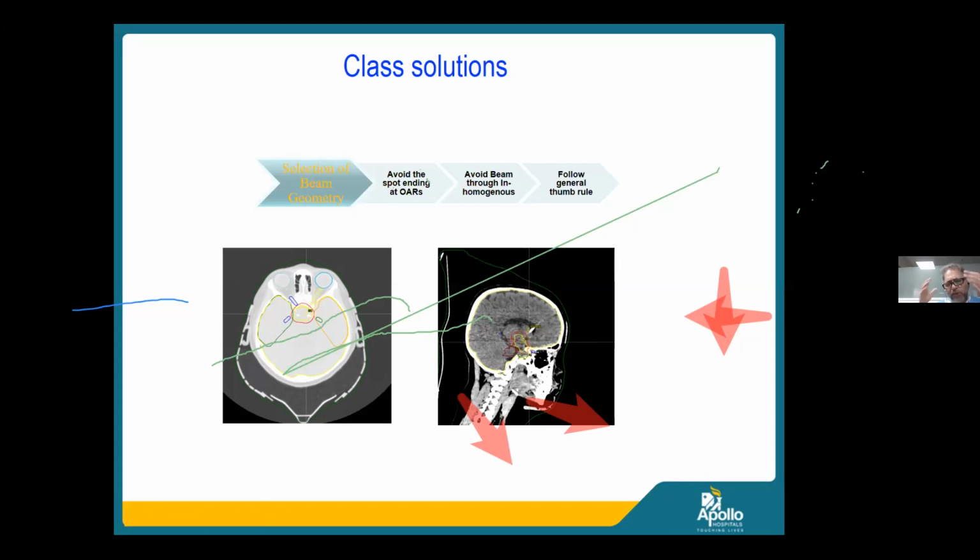So we spend so much time on what is called a pre-planning audit. When we make the mask and decide what field arrangement has to be there, we recognize which beams are likely to go through, not only to encompass the target volume, but also to avoid any structure which might cause perturbation of the dose and introduce a higher degree of uncertainty in the proton distribution within the target volume.